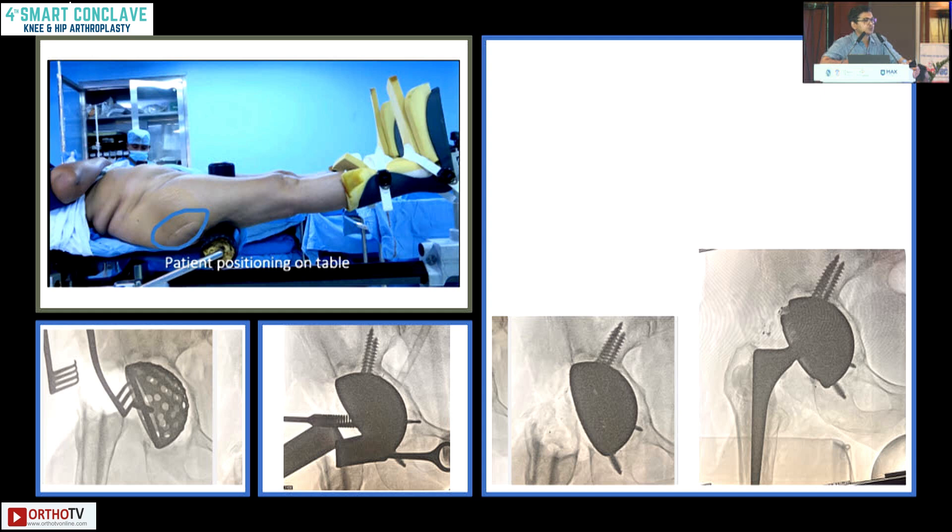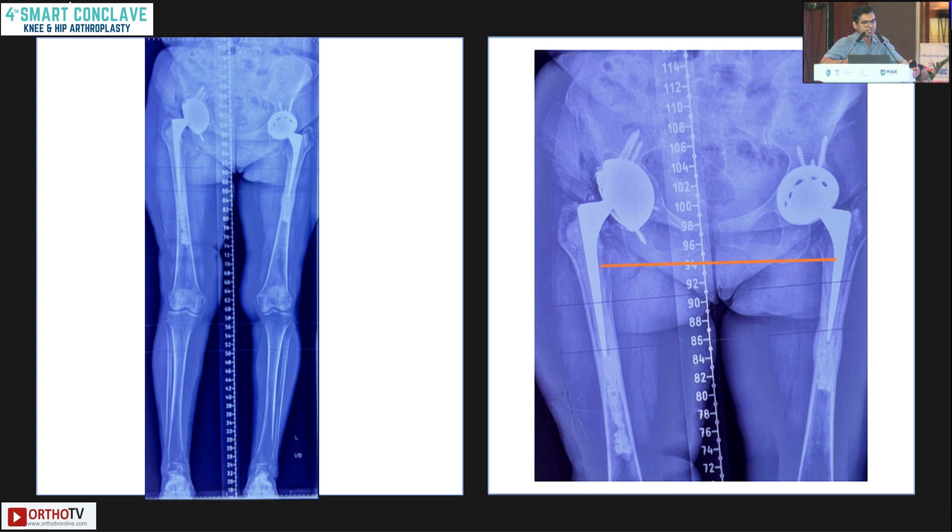This was the incision — you can see a posterior approach done around 20 years back, and now I'm revising on the same side with a direct anterior approach. The femur is well placed on the posterior side with cement still in situ. It's a very predictable acetabular reconstruction because you can see what you are putting in — you can see your ischial screw, your pubic screw, and screws going towards the iliac region. The acetabular reconstruction is more predictable because the patient is supine and the C-arm is incorporated into the reconstruction. The femur is cement-in-cement.